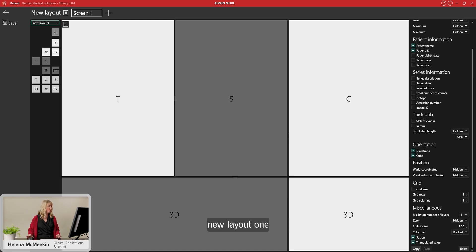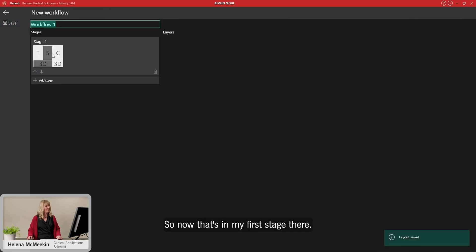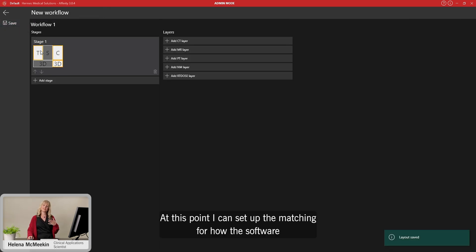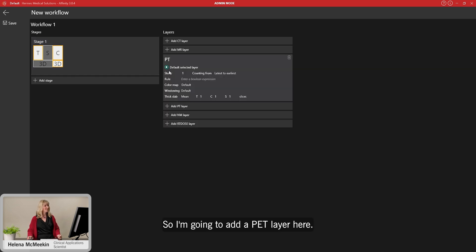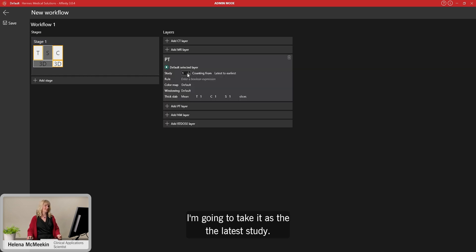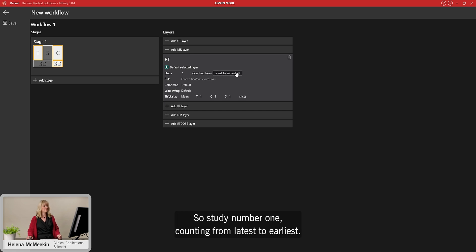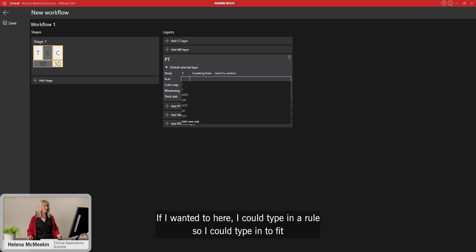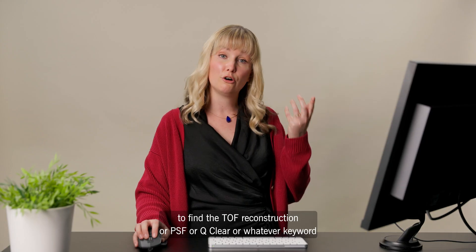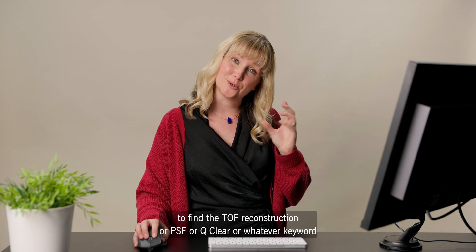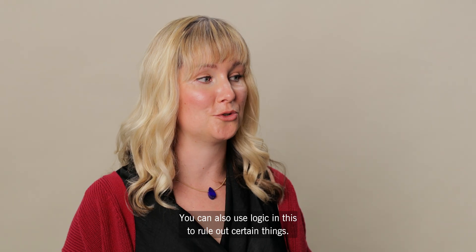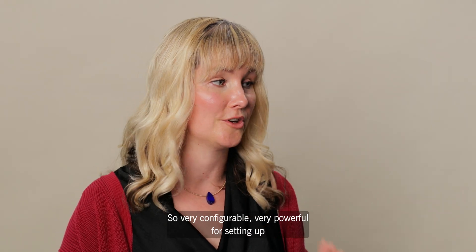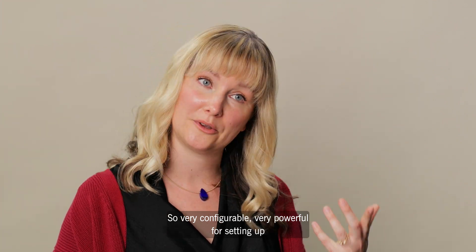I save this as a new layout. Then I set up the matching rules for how the software loads input data into this layout — adding a PET layer from the latest study (study number one, counting from latest to earliest). I can type in rules to find specific reconstructions such as TOF, PSF, QClear, or any keyword from the series description, and use logic to rule out certain series. This makes the setup very configurable and powerful.